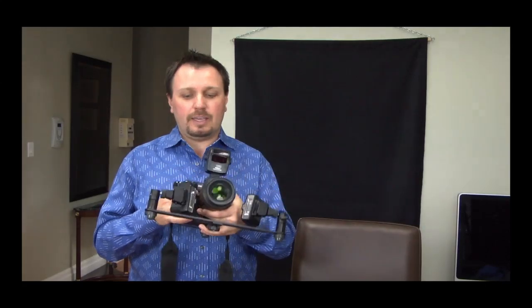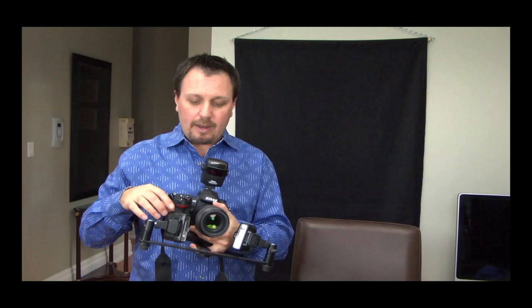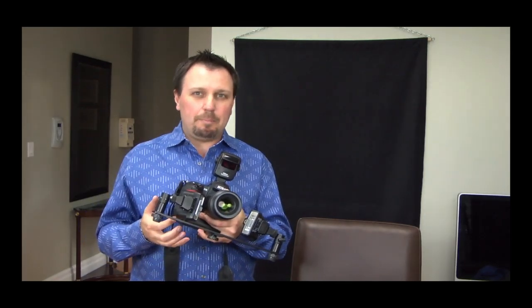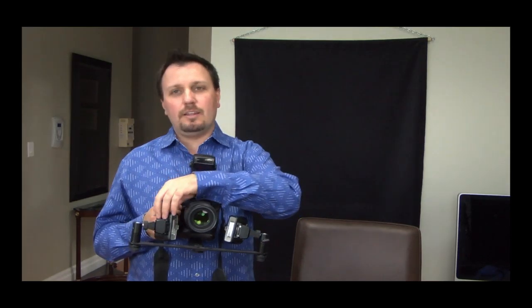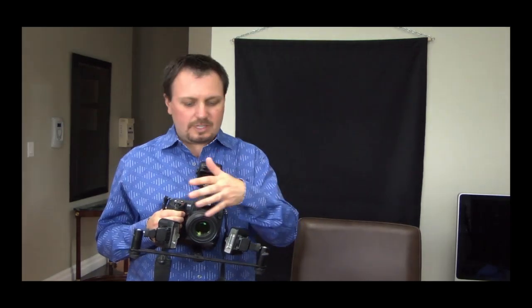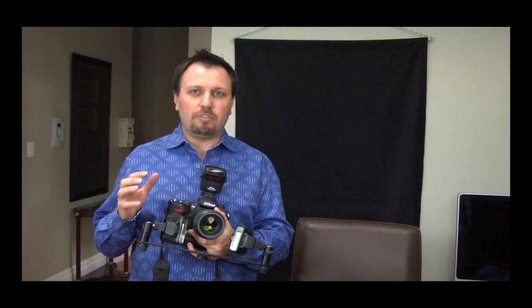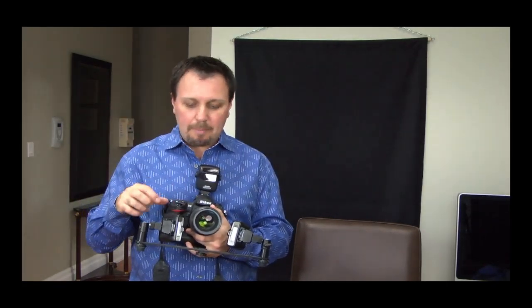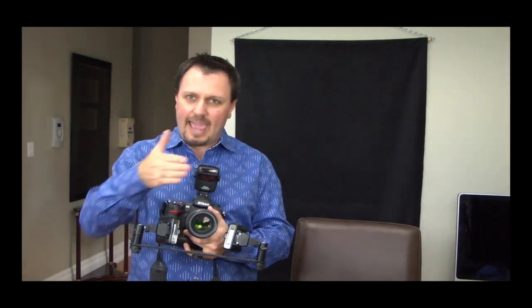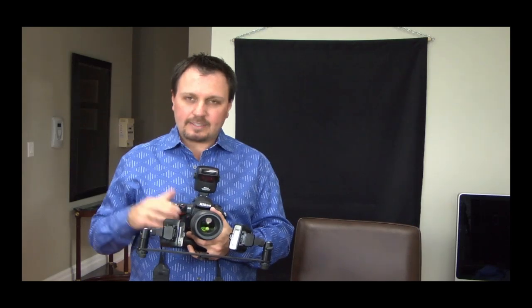Then I have the R1C1 macro photography flash setup, which has two wireless flash heads. I've mounted them on a bracket that I purchased from Photomed. The nice thing about this bracket is the flash heads are a little further away from the lens, so you never get red eye on portrait photos, and you also get better definition of the line angles of your teeth with the flashes at a distance and angled towards the lens.